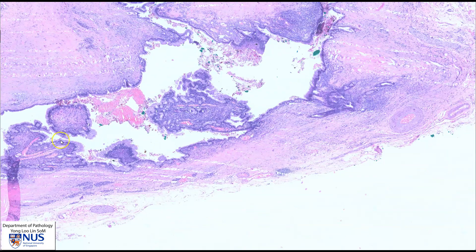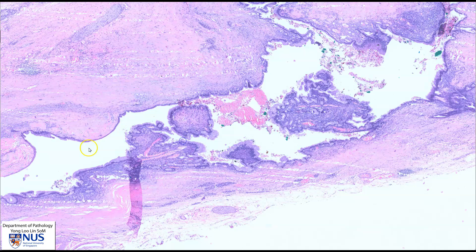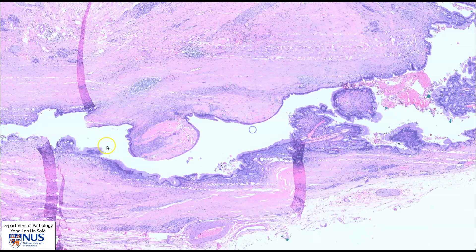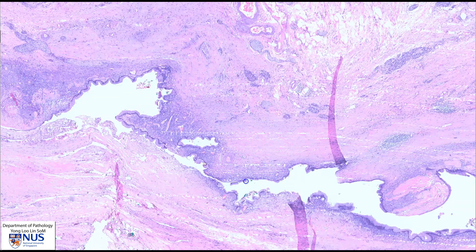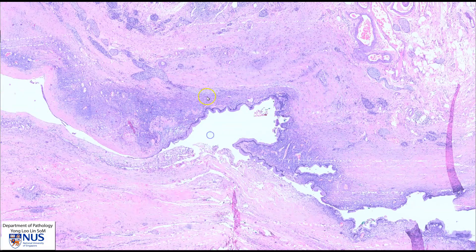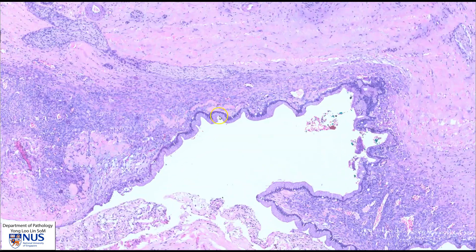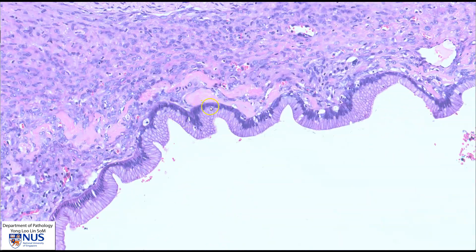Let's just move along this cyst locule. Here we can see very beautifully the low-grade mucinous epithelium and the underlying ovarian-type stroma.